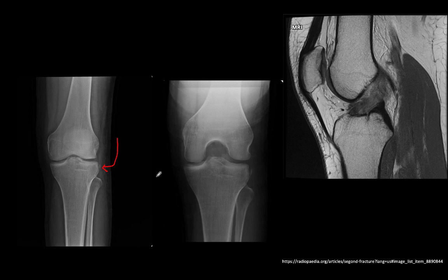The image off to the far right is an MRI examination, or at least a T1 weighted slice through the ACL plane from that knee scan. And what usually should be very taut and linear low signal fibers to represent the ACL is just a jumbled iso-intense mess. This patient has an ACL tear associated with the Segond fracture.